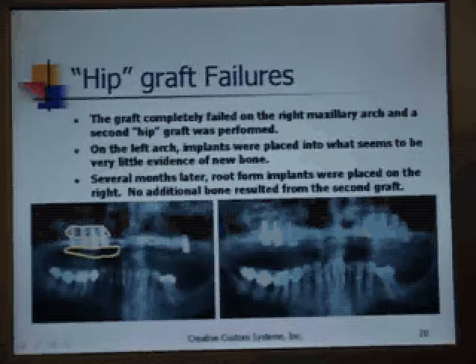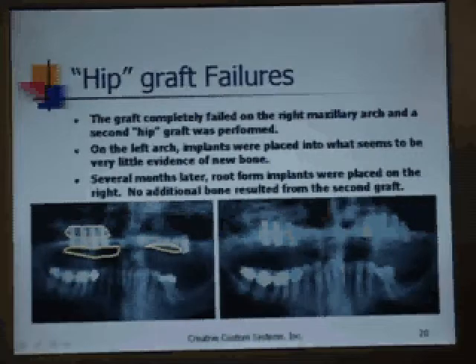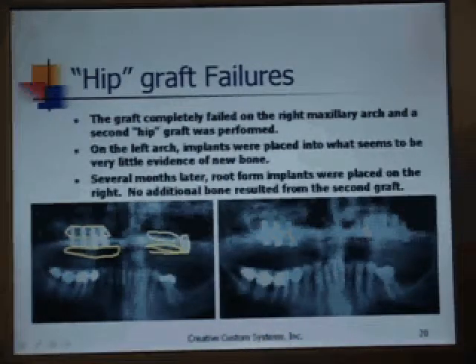Over on the other side, this hip graft completely failed, and you can see the original implant that wasn't removed from the original implant is still here, and you can see the bone level here has not changed at all. There is some indication of hip graft here.